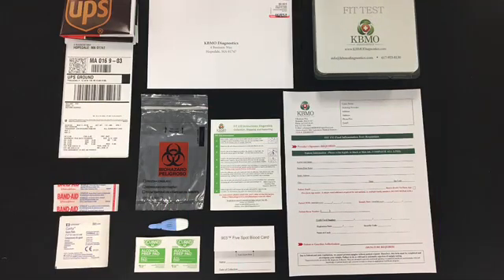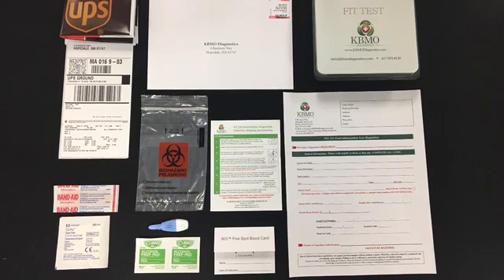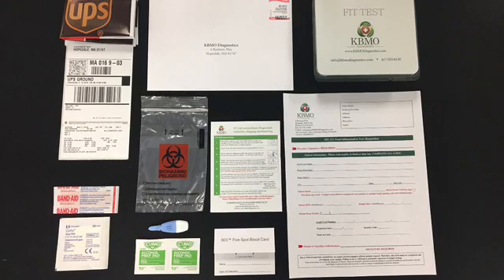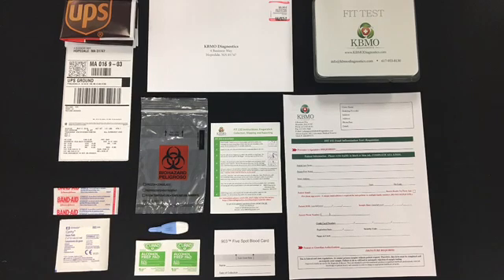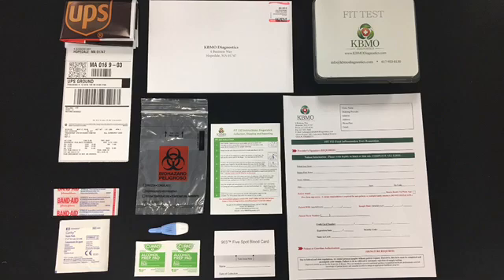First, open the kit to ensure you have the following items: finger stick collection instructions, a blood spot card, a biohazard bag, an alcohol prep pad, a sterile single-use lancet, a pre-stamped mailing envelope or a UPS bag with a return label, and a patient requisition form to be filled out to completion.